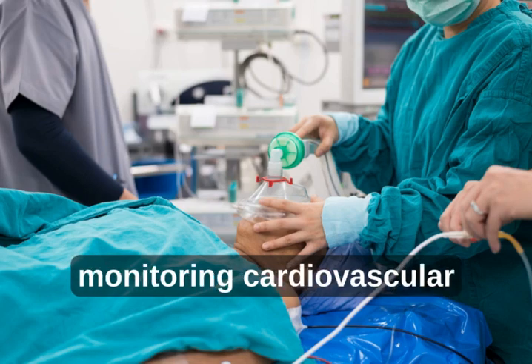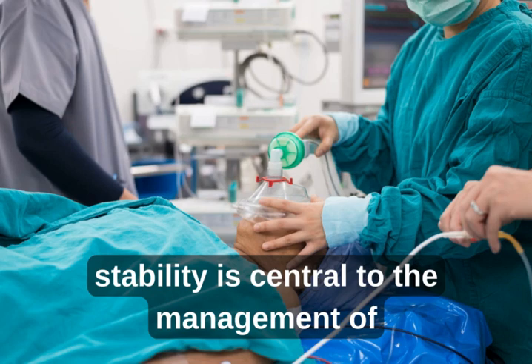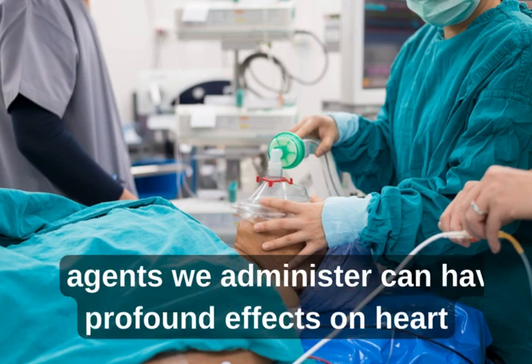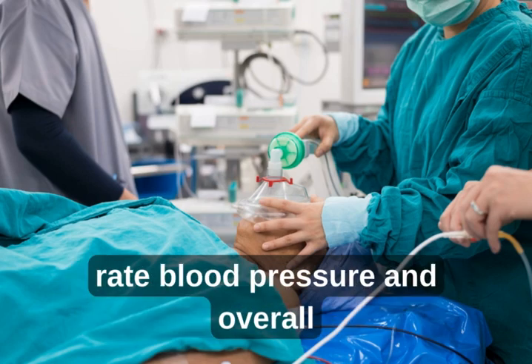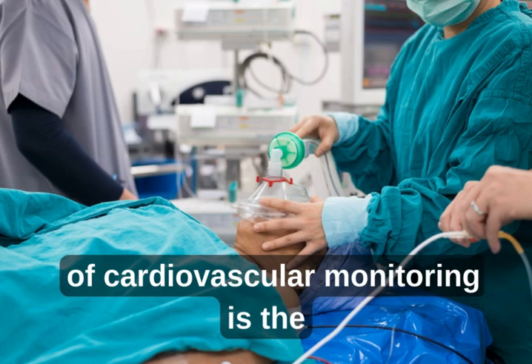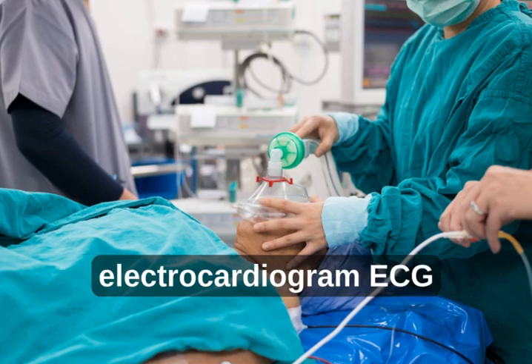1. Cardiovascular monitoring. Cardiovascular stability is central to the management of anesthesia. The anesthetic agents we administer can have profound effects on heart rate, blood pressure, and overall circulatory function. At the core of cardiovascular monitoring is the electrocardiogram, ECG.